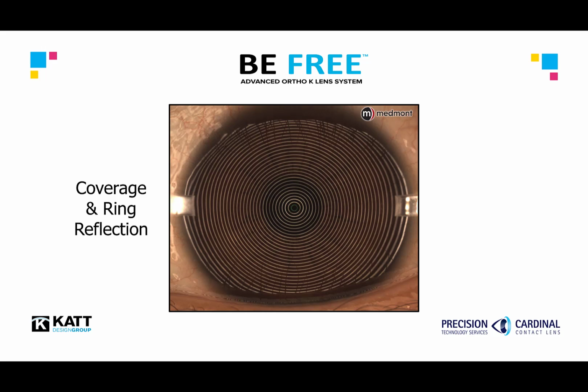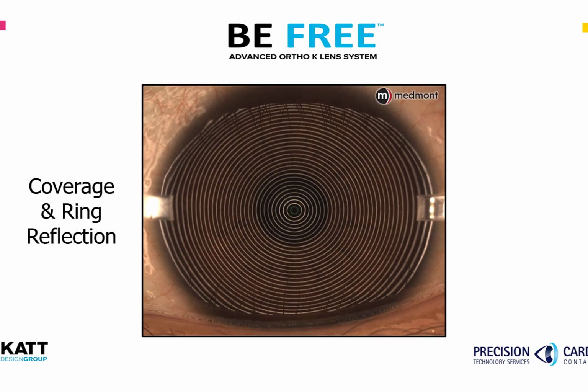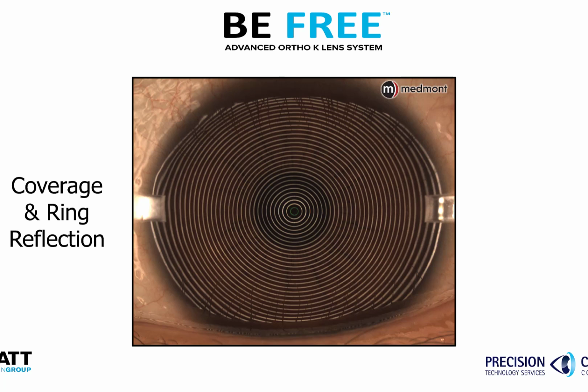Here we can see a good placido topography capture, where the lids are primarily out of the way. The eyelash shadows are minimized. The rings appear to reflect in a parallel and even manner.